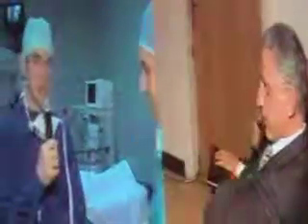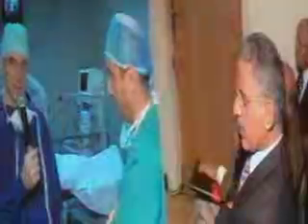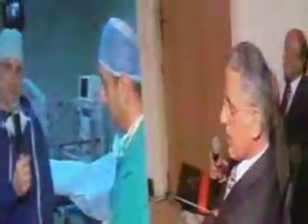I don't have any tricks. Did anyone get the question? Otherwise you have to repeat your question. Yes, I mainly think about the astigmatism induced by bulging of silicon oil through the posterior rexis. I have only one option for this: remove the silicon oil as soon as possible, that means after 3 months or so.